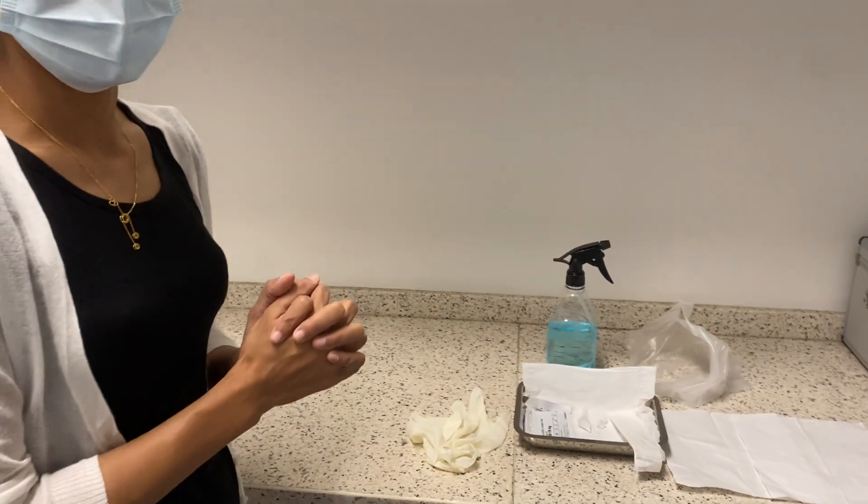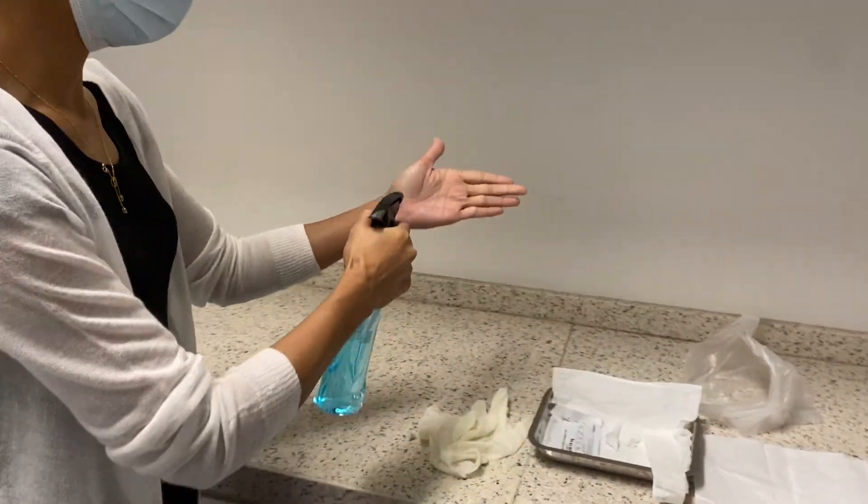Before doing anything, we need to wash our hands with soap and water or use hand sanitizer.